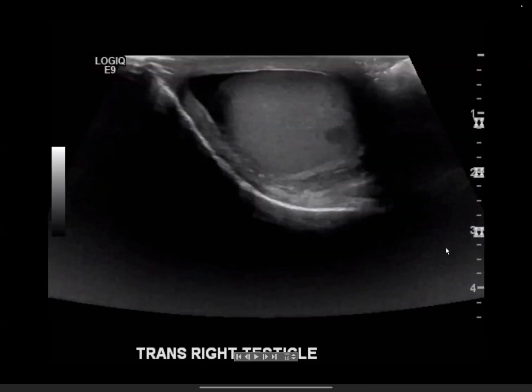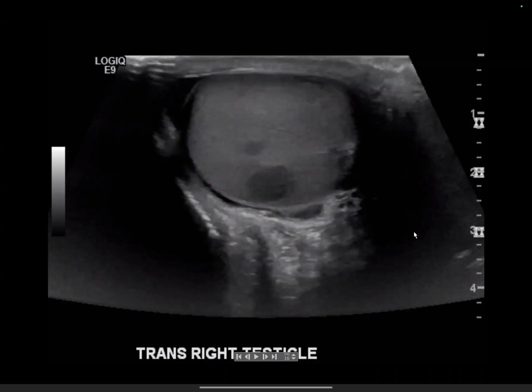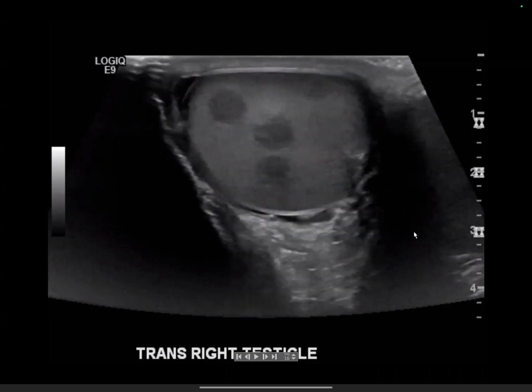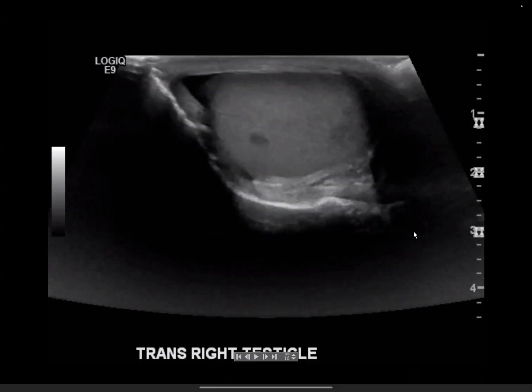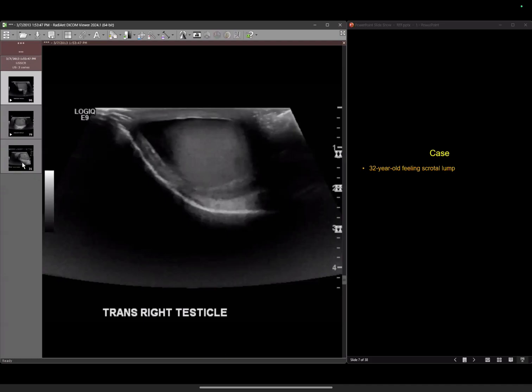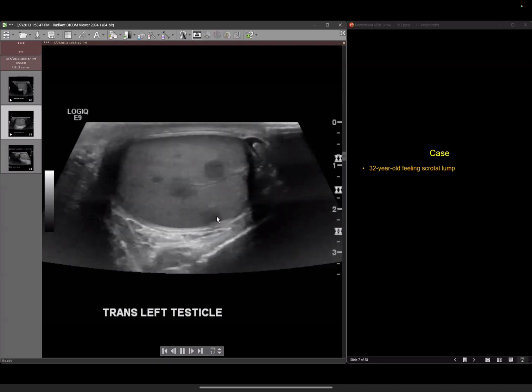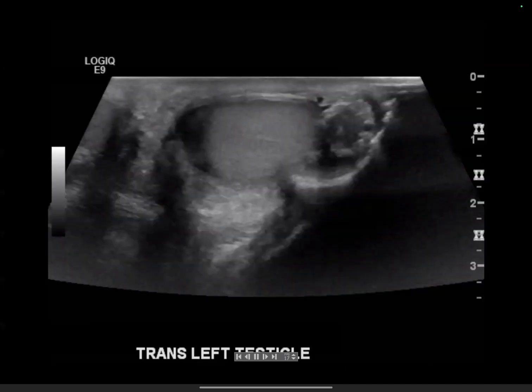Here's the right testis. Let's look at the left side. So this is the left side.